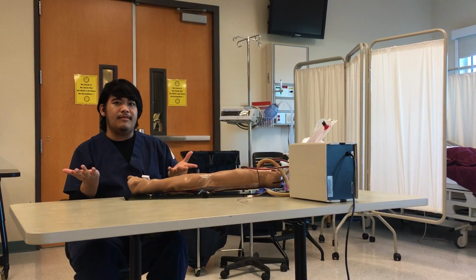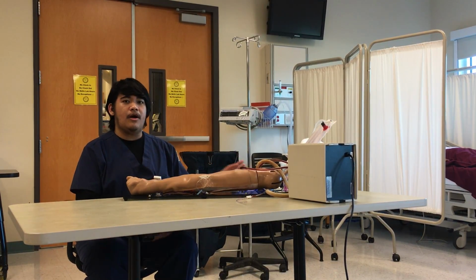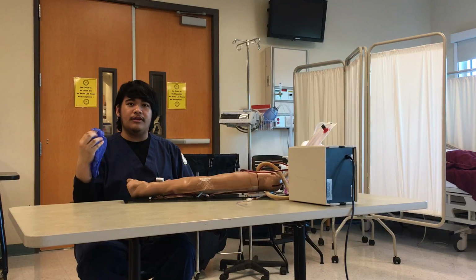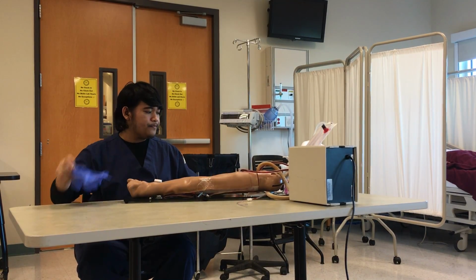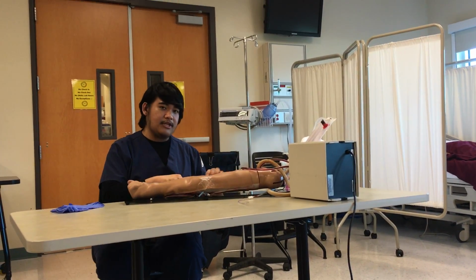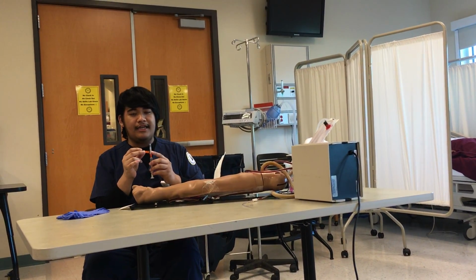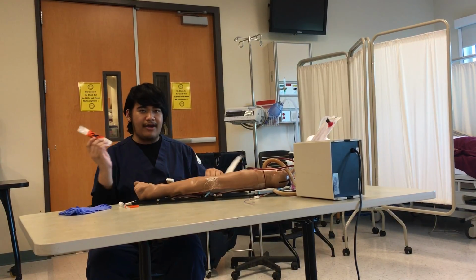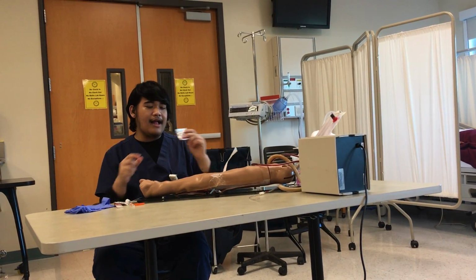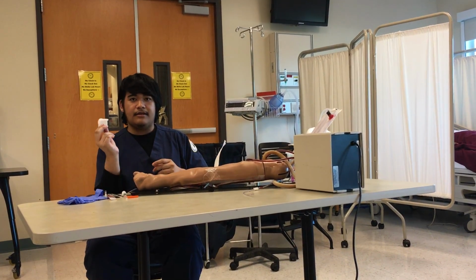Once we get all the information and we know all the contraindications, we are going to grab our equipment. We need a pair of gloves, a size smaller than what we usually wear, and an ABG kit. In this kit, we need to make sure that we have the requisition slip, a heparinized syringe, a needle with a cap, a biohazard bag, iodine, a band-aid, an alcohol prep pad, a cap for later purposes, and a gauze.